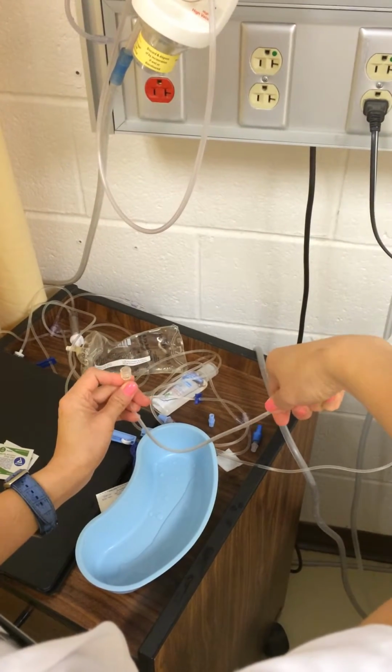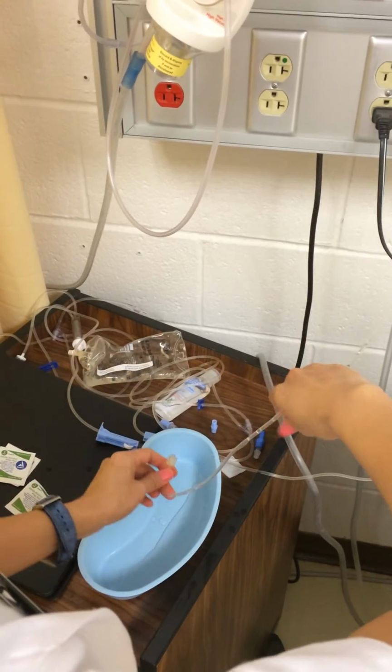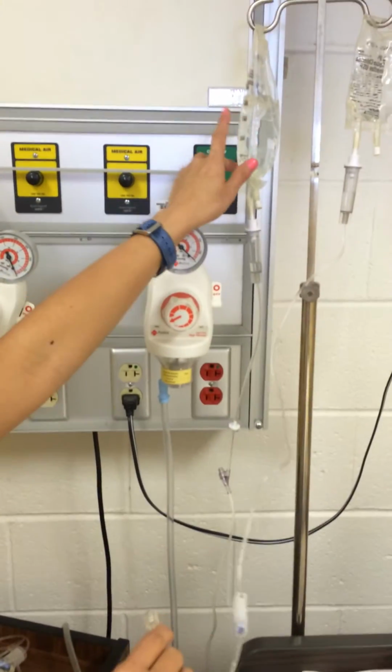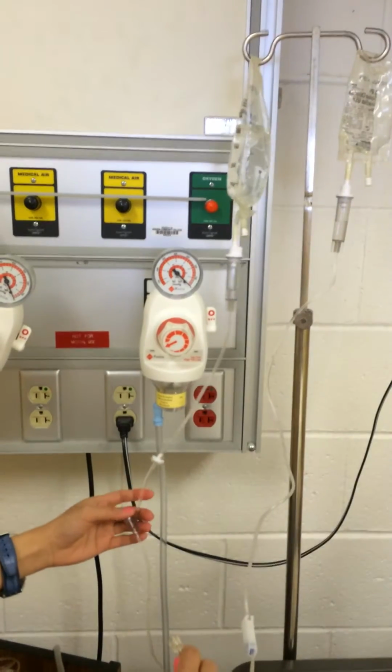Okay, I already primed the tube, and I am going to attach it to the primary IV solution.